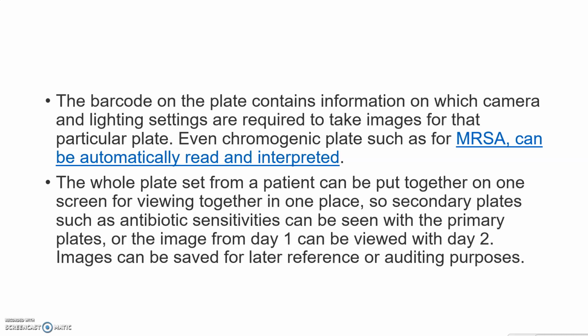The whole plate set from a patient can be put together on one screen for viewing together in one place. So secondary plates such as antibiotic sensitivities can be seen with the primary plates, or the image from day 1 can be viewed with the day 2. Images can be saved for later reference or auditing purposes.